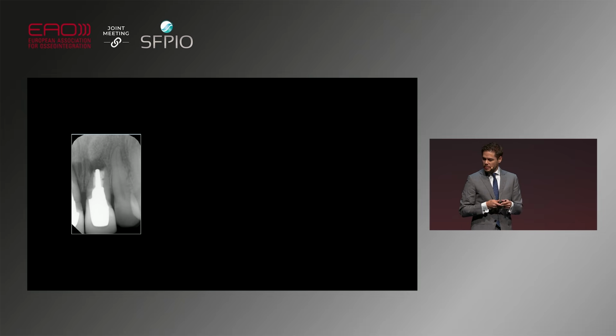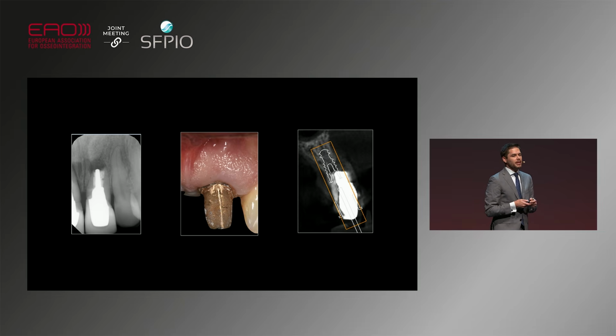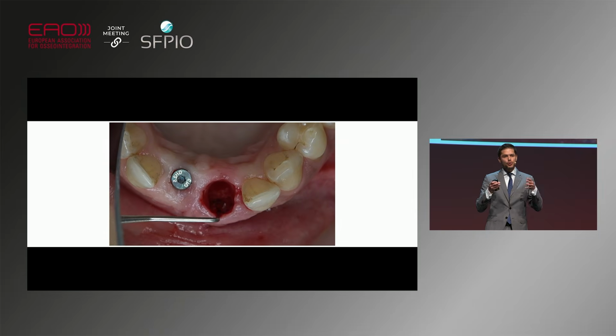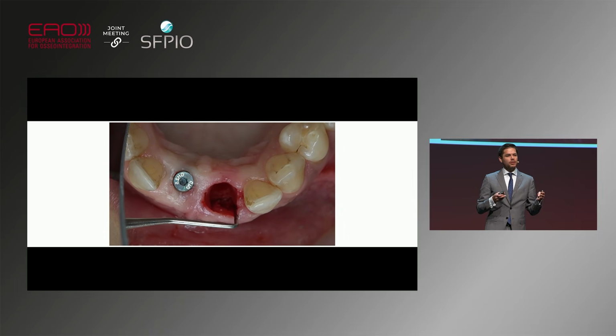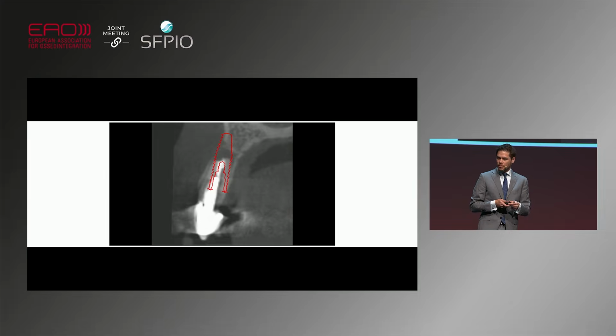But if I show you this patient that has repeated abscesses in the central incisor, this is a patient with long-standing trauma in the central and also in posterior sides. The tooth is fractured, has caries. So now we take a CBCT, and this is the placement. You can see that I can place the implant, I can anchor the implant, but I have an important buccal dehiscence. So this is the image in the video. You see there is a wide U-shaped dehiscence, and I have a lot of unsupported tissue. To me, I would take too many risks here placing an immediate implant. I'm more comfortable performing a ridge preservation procedure.